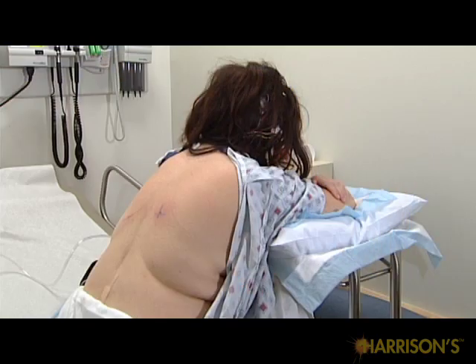Once you determine that thoracentesis is indicated and you have the appropriate labs, imaging, and informed consent, have the patient wear a hospital robe with the opening in the back to expose their posterior chest. Position the patient in the seated position if possible, with a table at chest height in front. The patient can lean on a pillow properly positioned on the table in front to expand the posterior rib spaces.